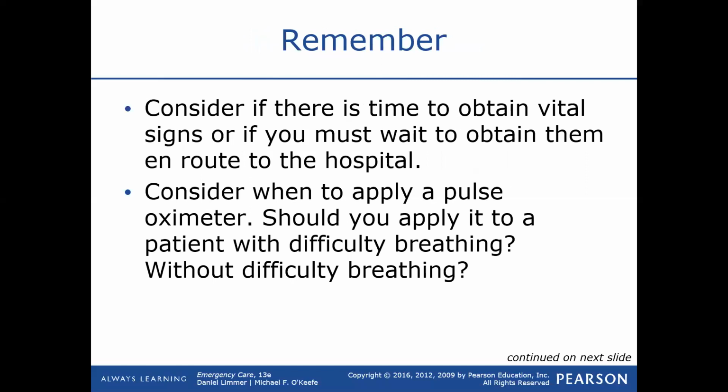Remember, consider whether there is time to obtain vital signs, or if you must wait and obtain them en route to the hospital. If there is time to obtain vital signs, you do your best to get that set of vital signs early on, but don't walk right up to your patient with a blood pressure cuff. You've got to do your primary assessment first, which is your ABC stuff, which we haven't really got too much into yet, I know. But getting vital signs early on is very important, okay?